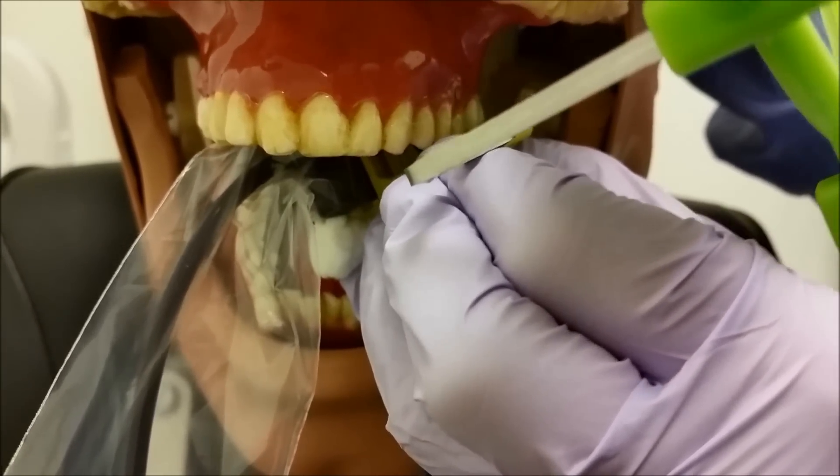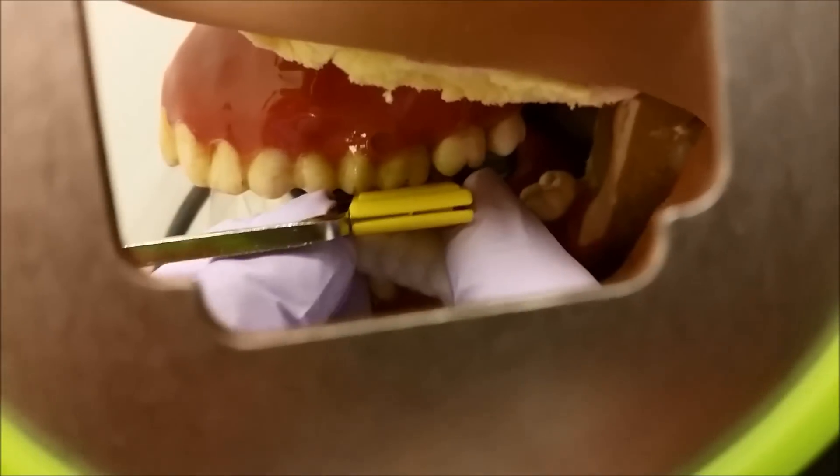Getting as far forward as we can, because we want to get the mesial of the first premolar. I'm going to go ahead and bite him down.